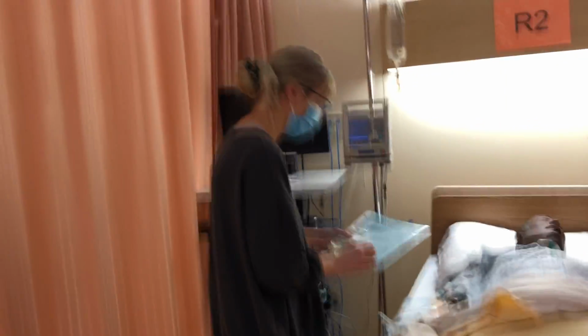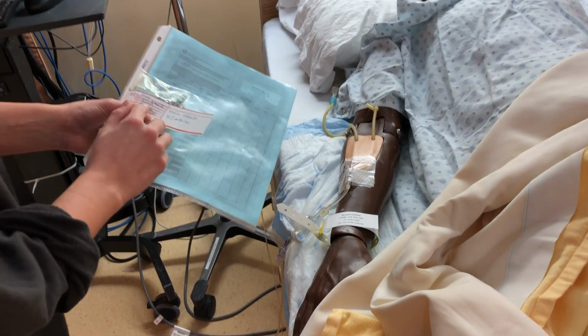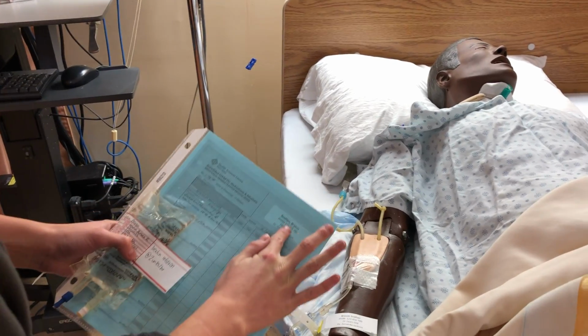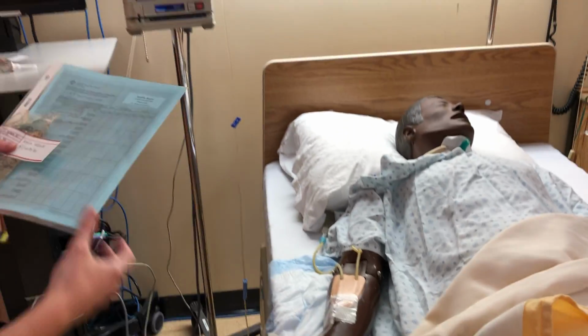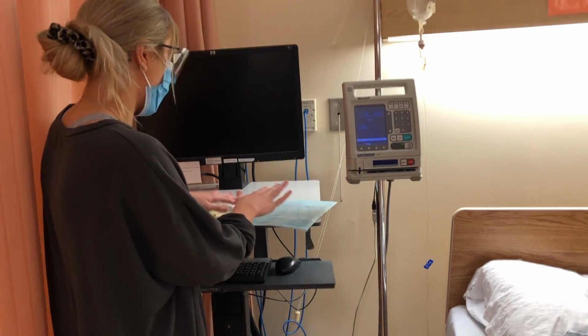And I'm just going to confirm that we have Scotland Bryson, Scotland Bryson. We have FIN 1 2 3 4 5 6 7 8 9, FIN 1 2 3 4 5 6 7 8 9. Okay, that matches. I'm just going to do a third check here.